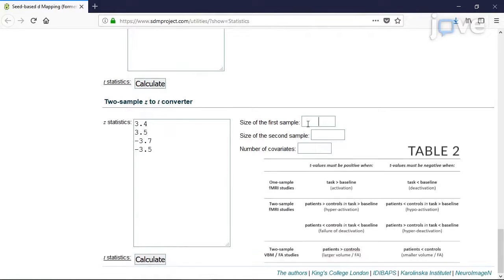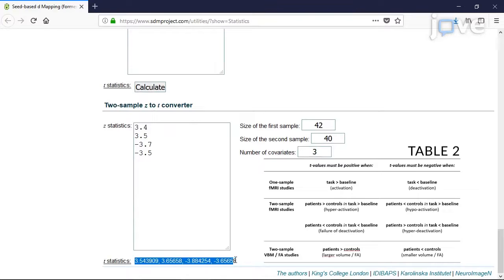Use the table for guidance on how to decide the sign of the T values. In two-sample studies, use positive T values when MRI signal is higher in patients than in controls, and use negative T values when MRI signal is lower.